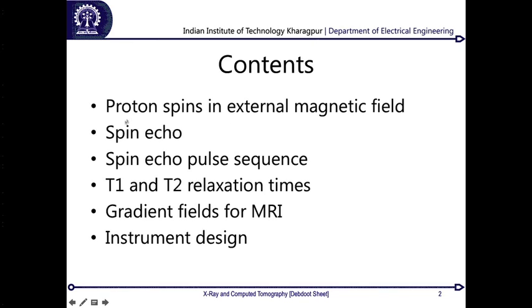From there, I will enter into the spin echo and the spin echo pulse sequences, which help us in doing two very interesting kinds of imaging in T1 and T2, called structural MRI. Now, up to here, there is no imaging which comes out. It's just signals associated with the resonance of the small magnets within your body, which is caused again by the water itself.